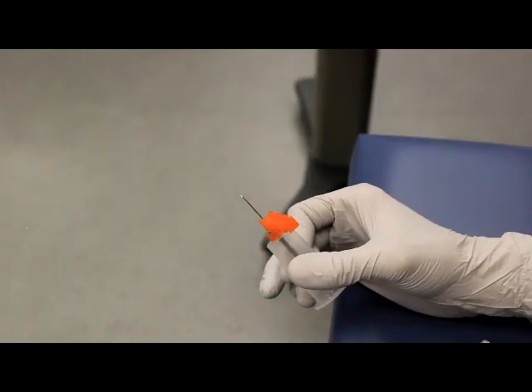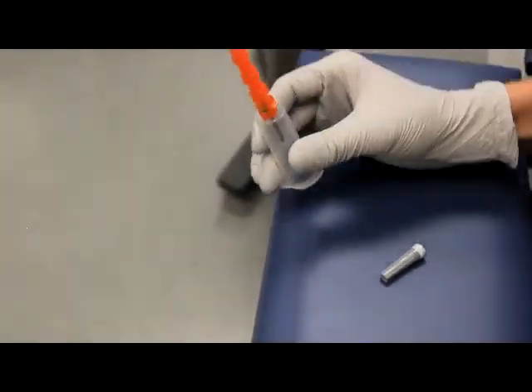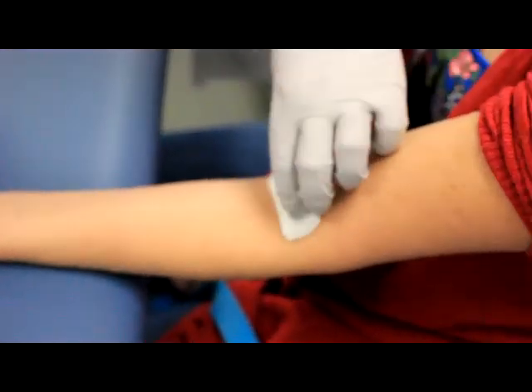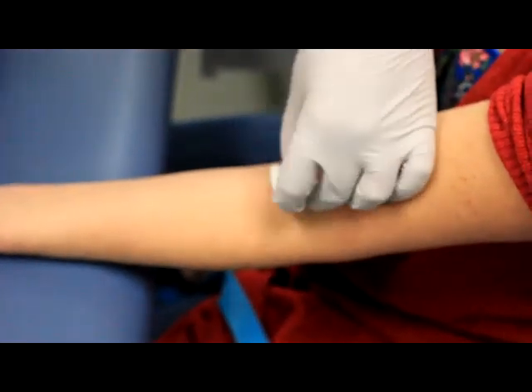Immediately safety your needle by pressing the orange safety device onto a hard surface and disposing of the needle in the provided needle disposal container. After 60 seconds of pressure, apply a pressure bandage by folding the gauze in half twice.